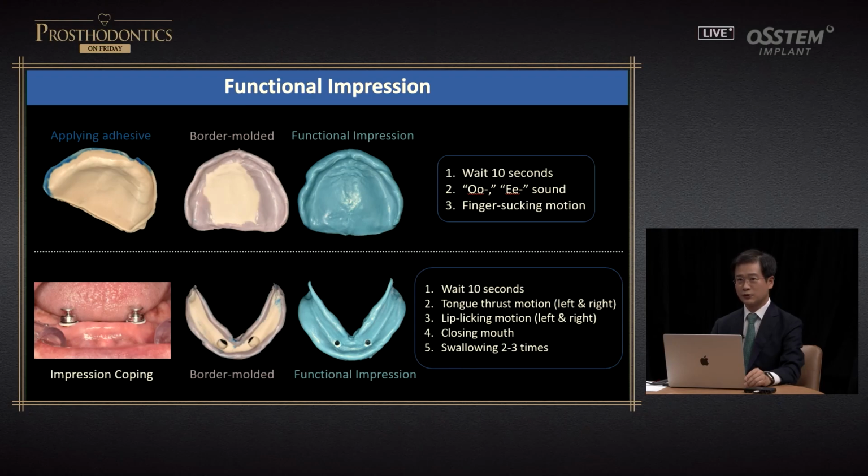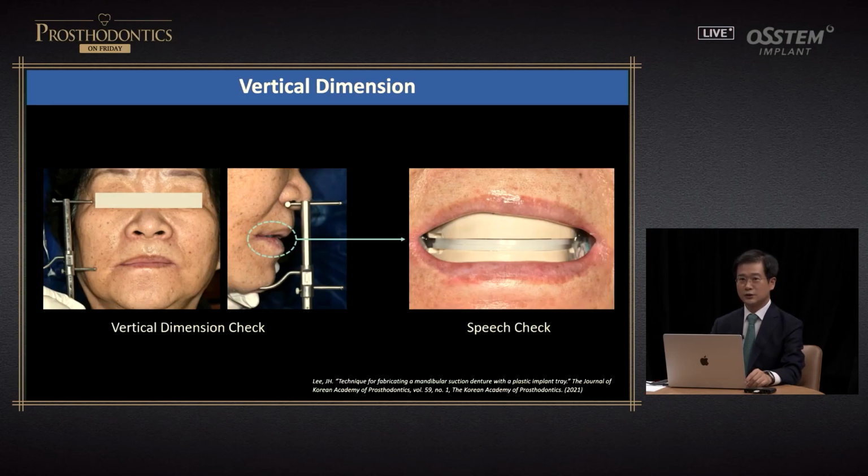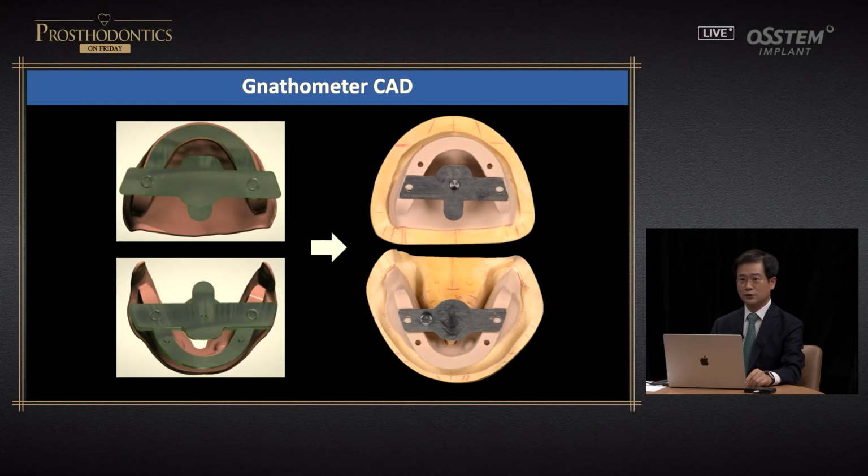I believe you already know about this. After that, this type of metal structure is put in the mouth to get accurate information.